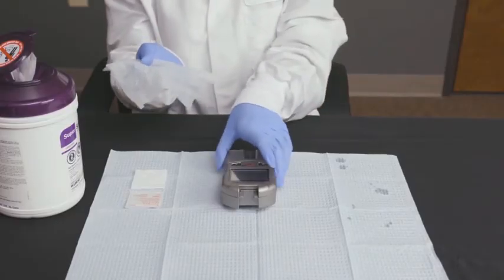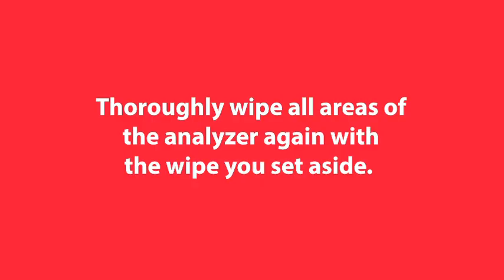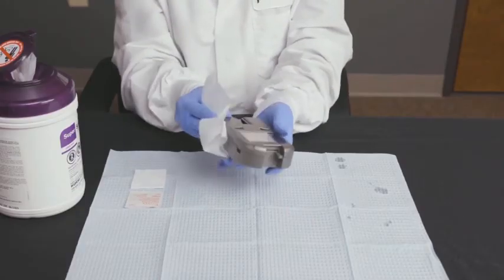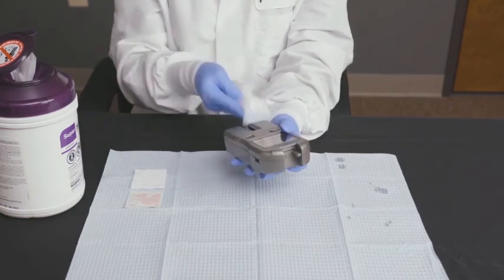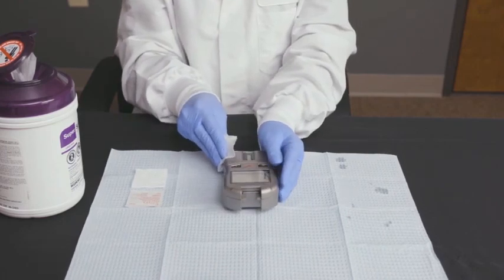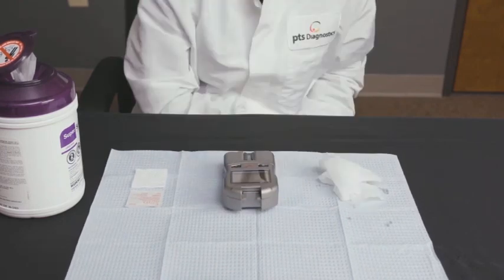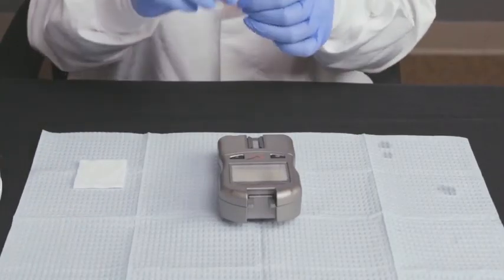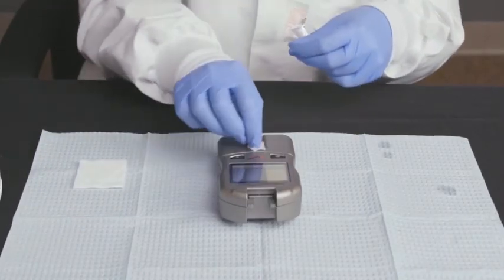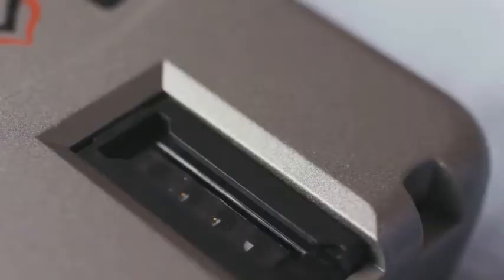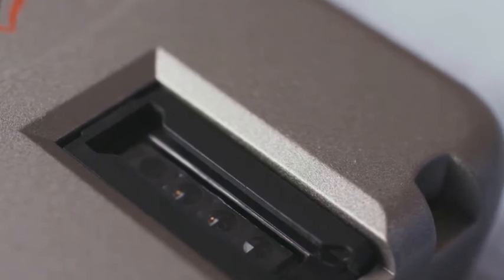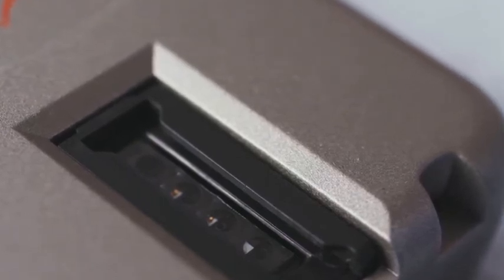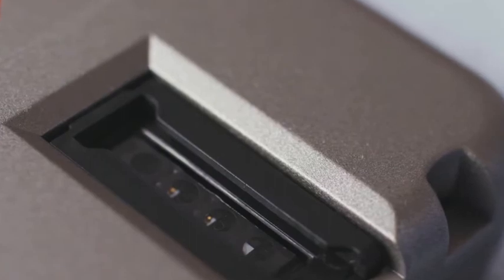Then disinfect the analyzer. Thoroughly wipe all areas of the analyzer again with the wipe you set aside. Keep the surfaces of the analyzer damp with disinfectant for two minutes — this is long enough to kill blood-borne pathogens. Once the necessary disinfectant contact time is up, allow the device to air dry completely. Clean the optical glass with an alcohol wipe to remove any residue left behind by the disinfectant, then dry with gauze. Inspect the optical glass at different angles to make sure it is clean before running your next test or placing the analyzer in the case.